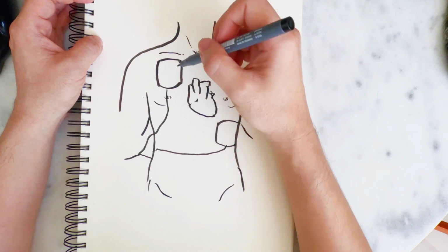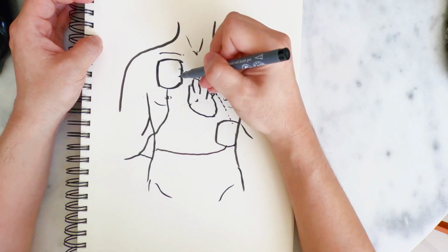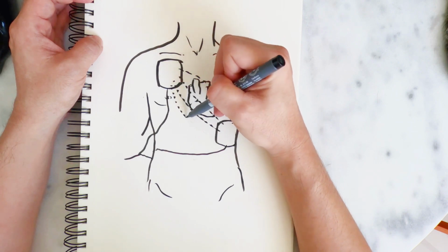This device operates in biphasic mode, and you can see that the current flows from one pad to the other. The electricity acts like a lure. It flows through and then returns to the other pad, passing through the heart perfectly. This is the appropriate method.